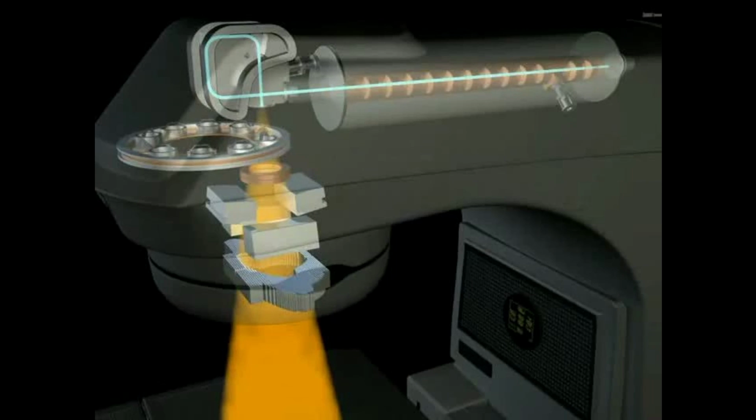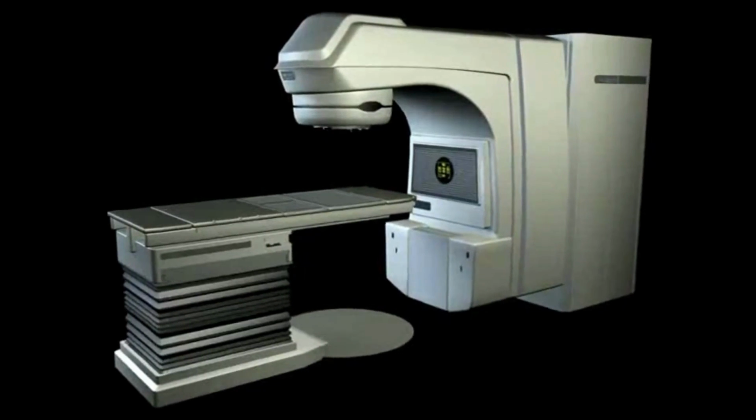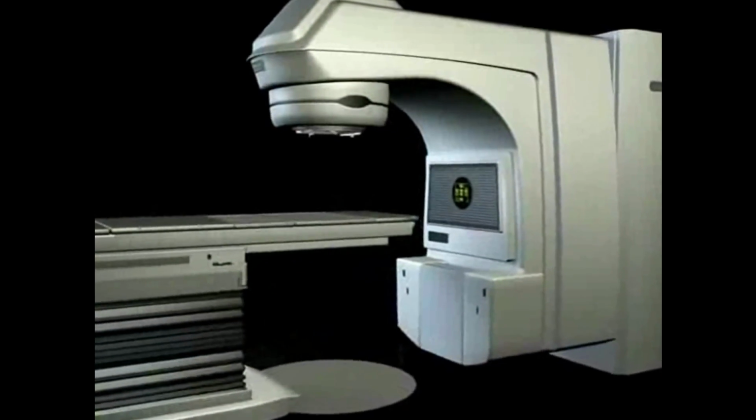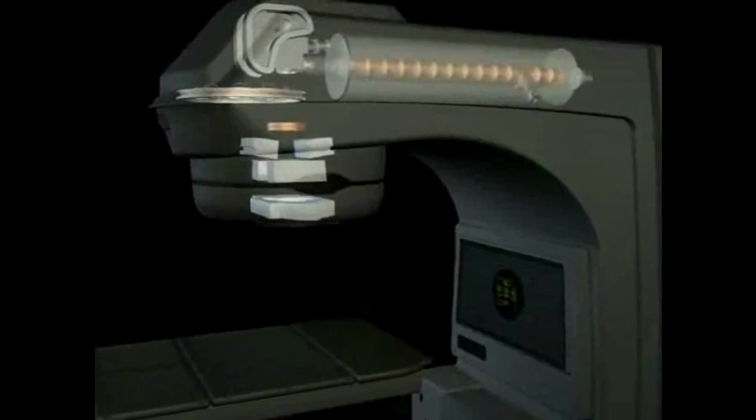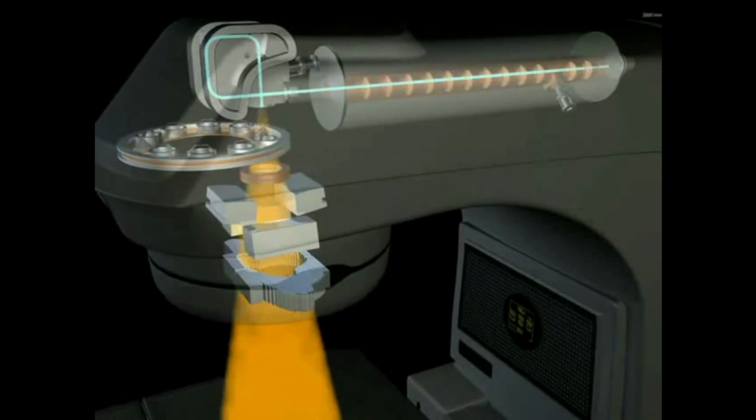To deliver the beam, we need a LINAC. So let's have a look at what's inside a LINAC. Let's zoom in and see the main components of a LINAC that will provide the beam exiting from the head. So you see that we have different parts in the LINAC. We will shortly review them. Starting from the right, we have an electron gun, so it just provides electrons. Then there is a radio frequency accelerating cavity that will, let's say, accelerate electrons to 6 MeV.